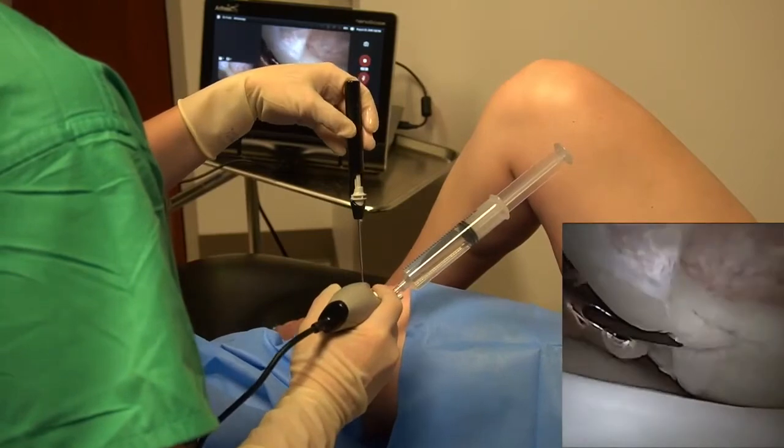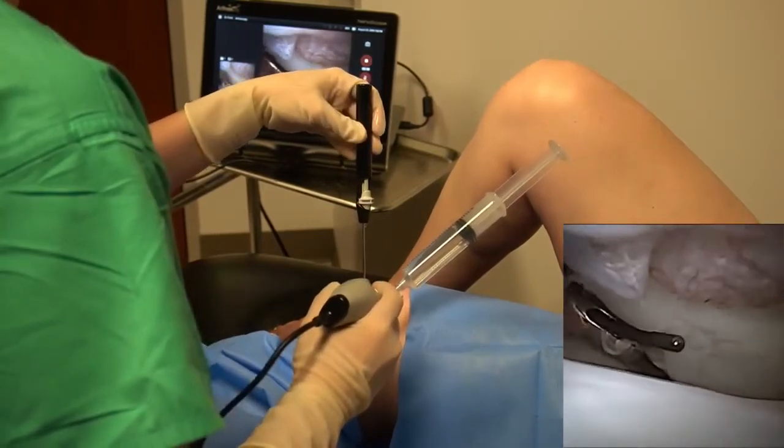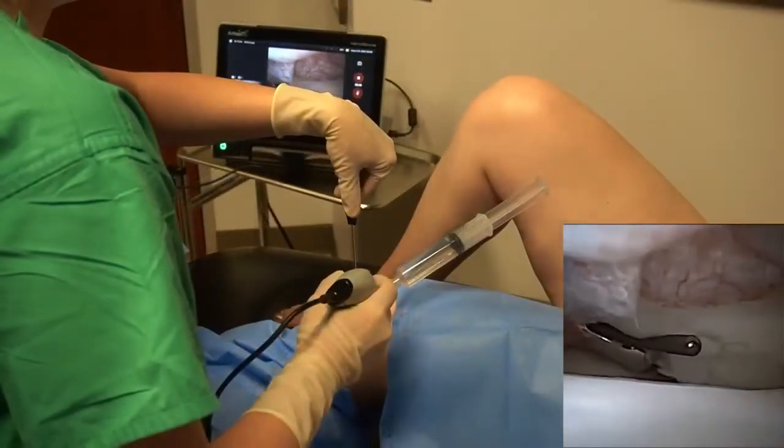If possible, have an assistant available to provide valgus stress or assist in patient knee positioning as the arthroscopy is being performed.